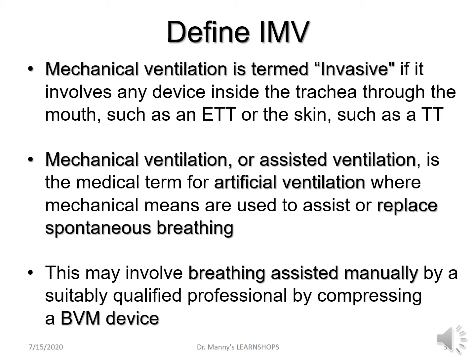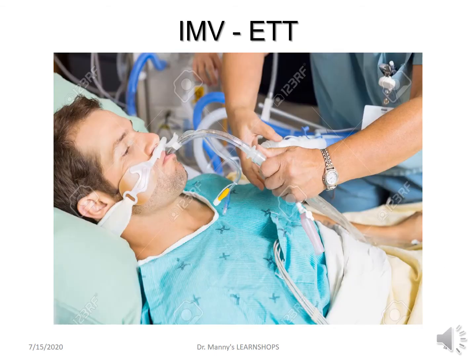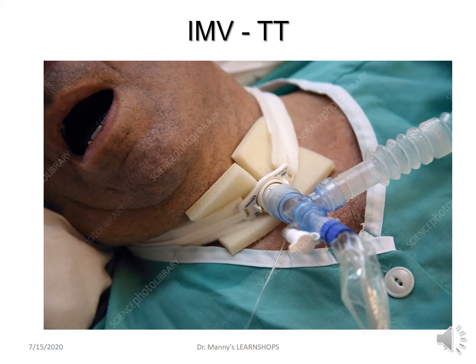This may involve breathing assisted manually by a suitably qualified professional by compressing a bag valve mask device. Here's an example of an endotracheal tube with invasive mechanical ventilation. Here's an example of a tracheostomy tube.